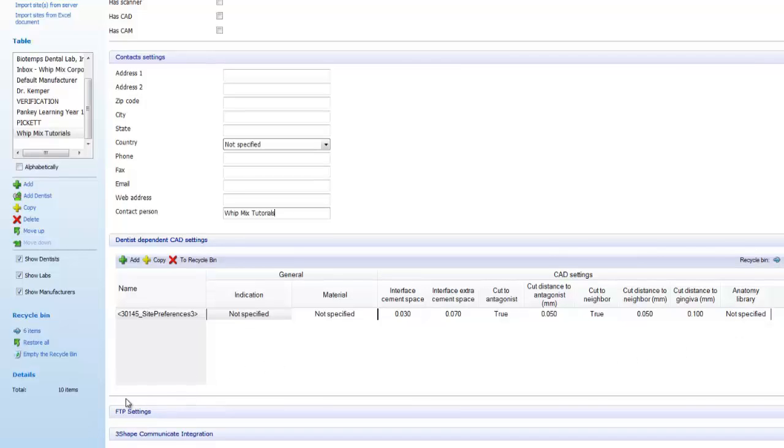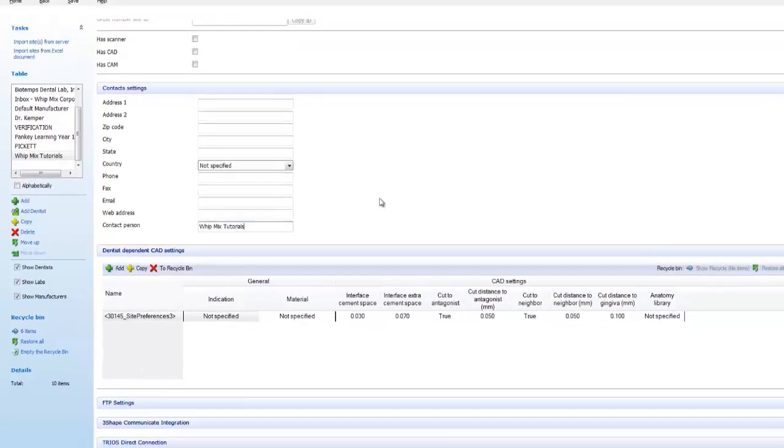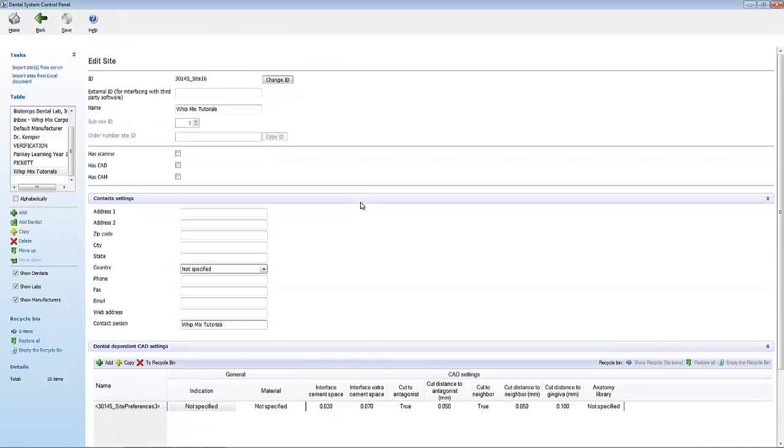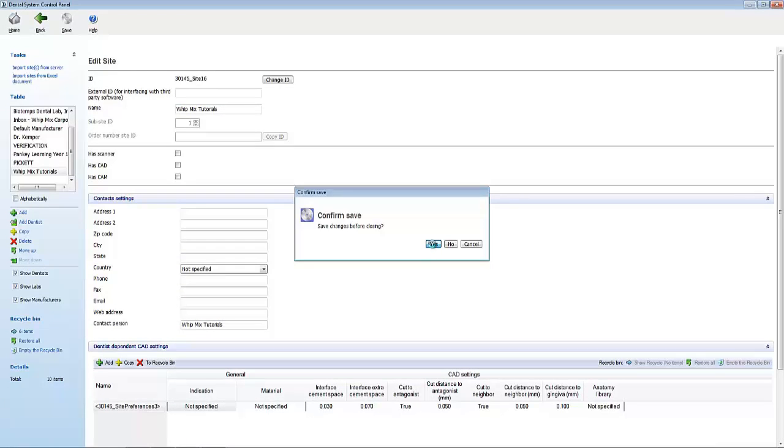There are some more options towards the bottom of the screen that we can change. But for now, let's click the X to the top right hand corner of the screen. When it asks you to save, make sure to say yes.